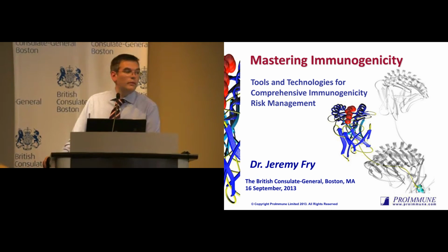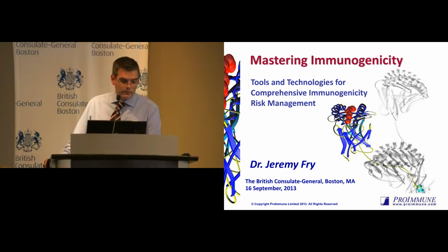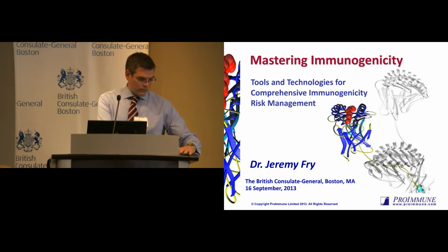In terms of the cytokine storm control question, this is also the question of how you really control this assay. And we followed a little bit the lead that Roche have taken on this, that Erbitux is something they've looked at as a negative baseline. There's of course this hypersensitivity response to it, but failing that, you typically see a very low cytokine response to Erbitux.